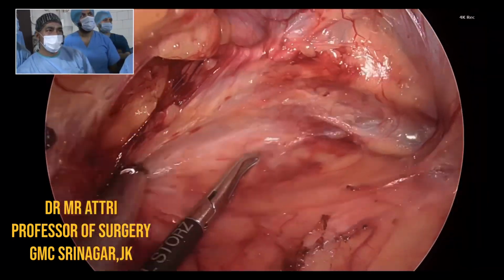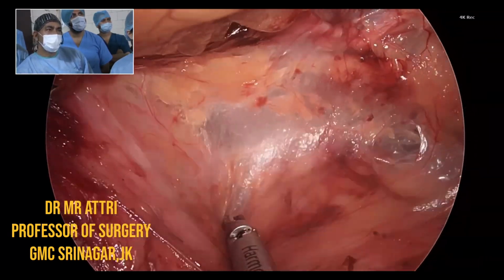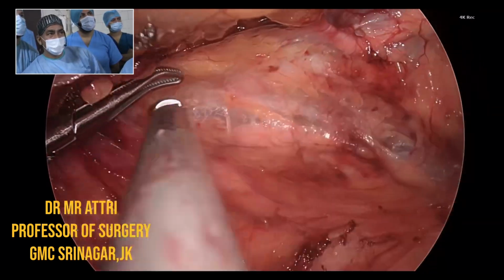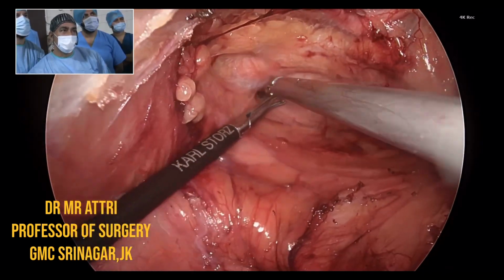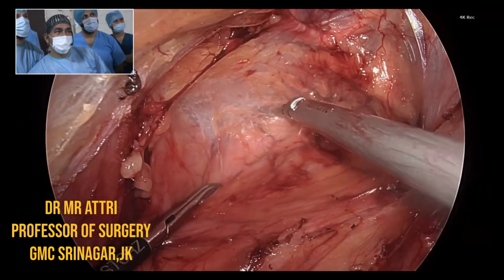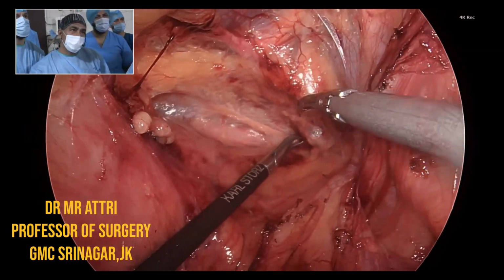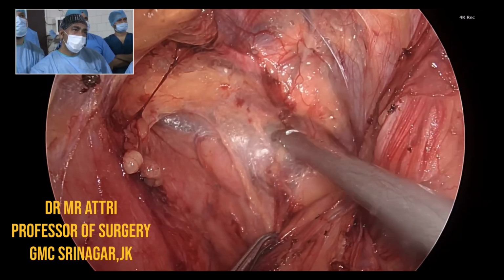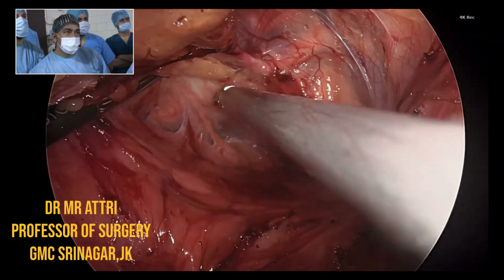This is the symphysis pubis, and since it's a recurrent hernia, otherwise also, we need to go at least 2 centimeters across the opposite side, even if there is no hernia on that side, because this is the medial-most recurrence, which is the common one, and we need to cover at least 2 centimeters beyond the midline. And as per the concept of the myopectineal orifice, the critical view of the myopectineal orifice, we have to go almost 2 centimeters below the pubic bone. So this is the pubic bone here.